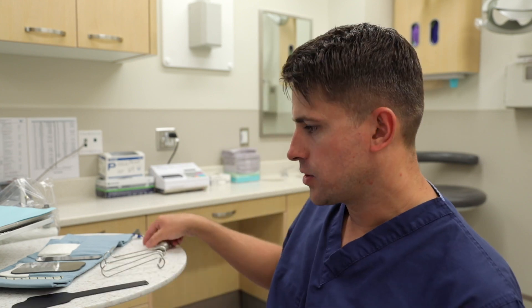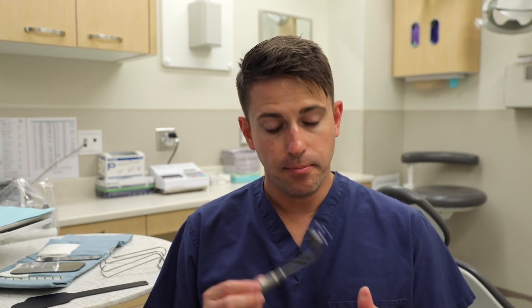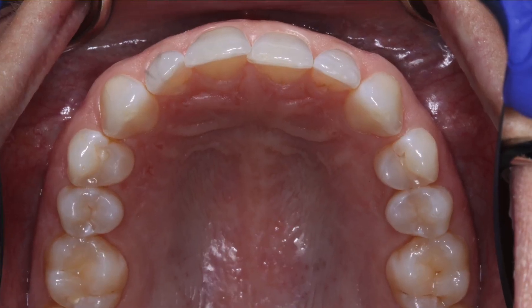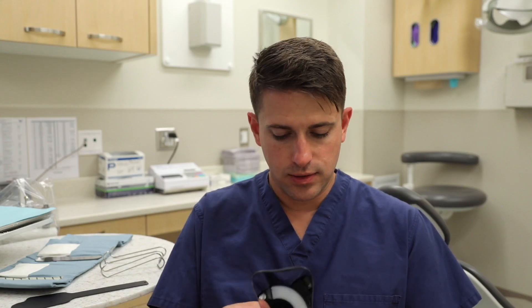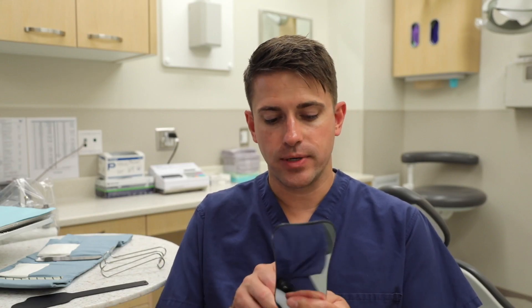The last thing I'm going to show you today is this device here, which is a mirror holder. When you're trying to hold a mirror in the mouth, you can have an issue where fingers creep in on the edges of the mirror and it's hard to get them out of the frame. You can buy a mirror handle like this one — you attach your mirror to it, it holds the mirror in place, and you can get your hands away from the mirror. You're less likely to get fingers and gloves into the photo.